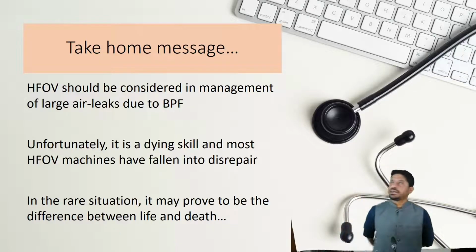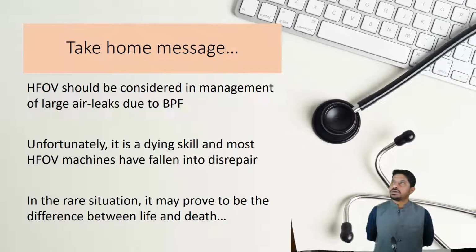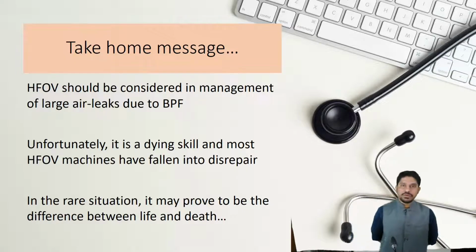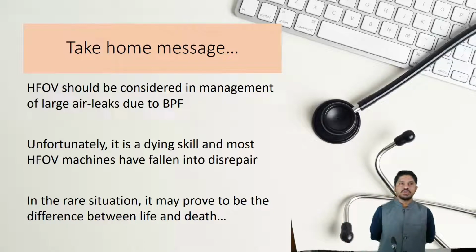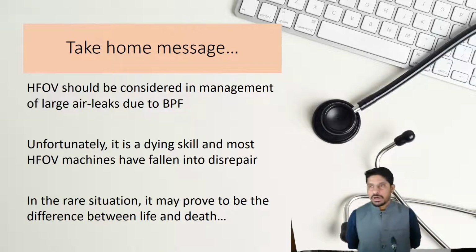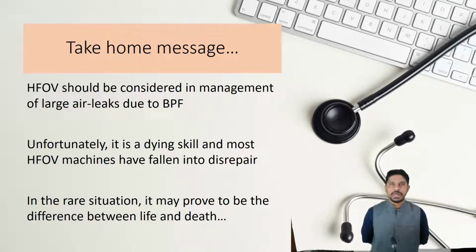So finally, our take-home message from this case discussion. HFOV should be considered as a management strategy in cases of large air leaks due to broncho-pleural fistula. Unfortunately, HFOV is a dying skill, and most of these machines have fallen into disrepair or been condemned and are not used anymore. However, the good thing about HFOV is that it is less of a ventilator.